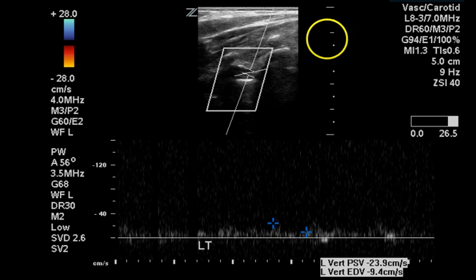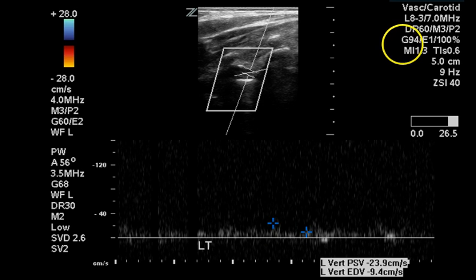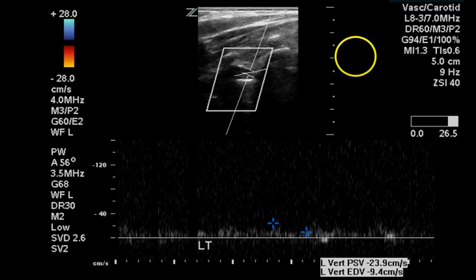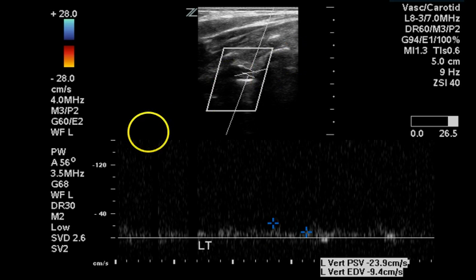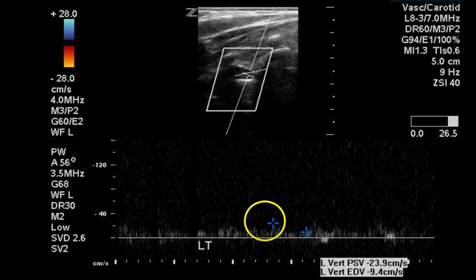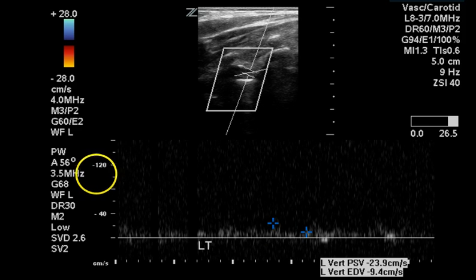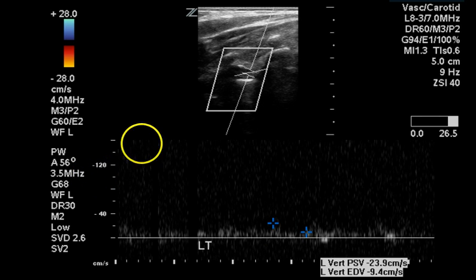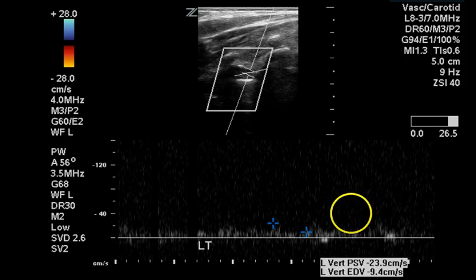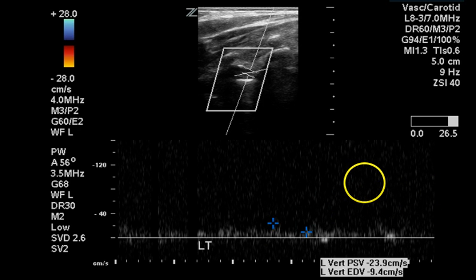The left vertebral artery should be flowing from right to left, or away from the transducer. We can see it angling downward, and that is what we're demonstrating with the negative sign on the velocity values. There is no color information from this image. This is a very dampened waveform, but it is antegrade.